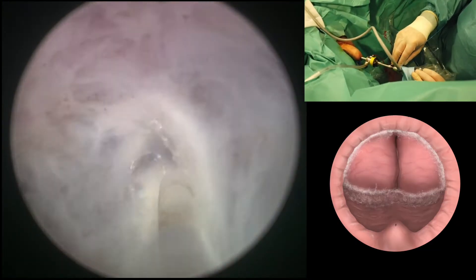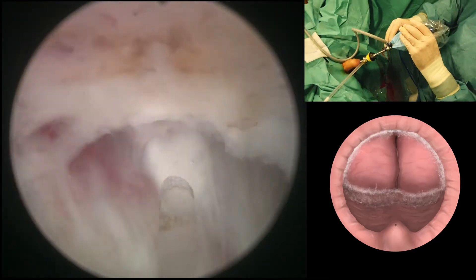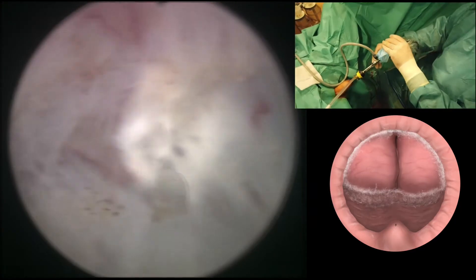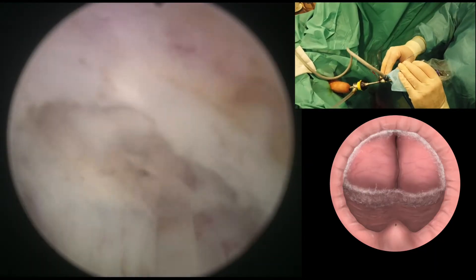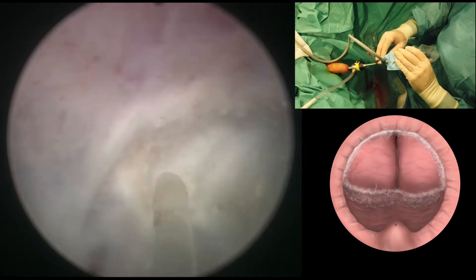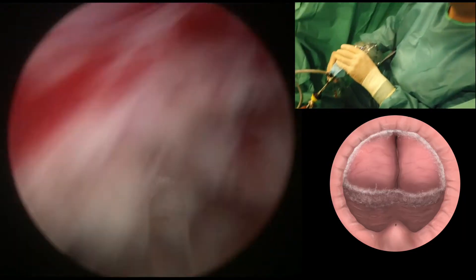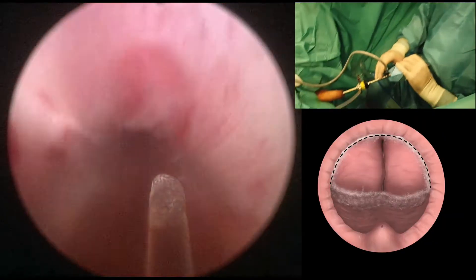Then we develop progressively the posterior plane. This development of the posterior plane can be done very fast; it's quite easy. It's important to keep a wide line that goes from side to side because that keeps orientation, and not always can we see a perfect clear plane of separation between adenoma and capsule. Keeping these lines around the adenoma is going to help us when it is not so clear where the plane is.